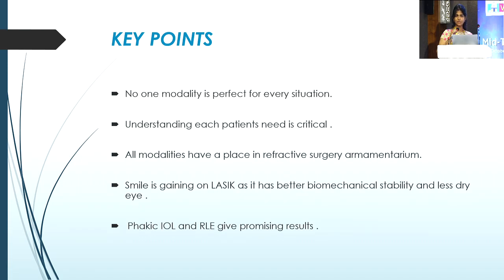Once we get SMILE for hyperopic correction and astigmatic correction, I'm sure all of us will go ahead and do SMILE for all our cases, except borderline corneas, for which we go ahead and do PRK. Phakic IOLs and RLE give promising results, but it is mandatory to get a pre-operative evaluation by a retinal consultant, because every time it is an intraocular procedure, and at any given point of time we have a risk of getting retinal complications. Thank you so much for your patient listening.